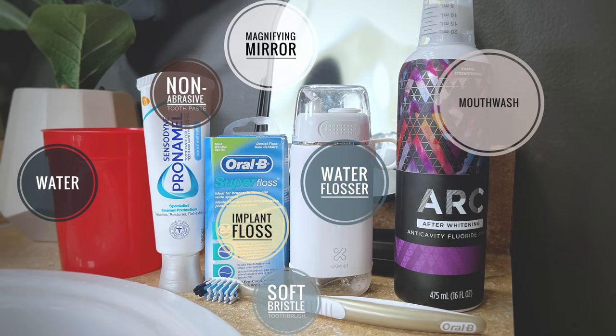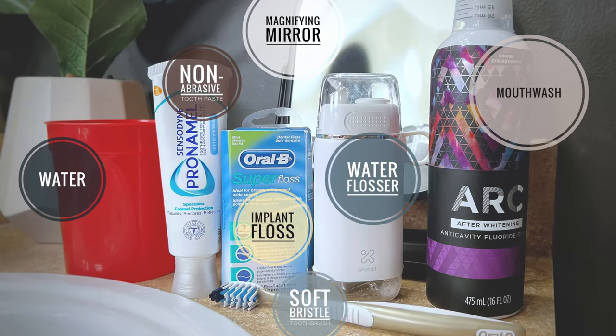Now I'm going to go over all of the products that I use every single time I clean my hybrids. The first tool is the most obvious one — a toothbrush, but it has to be a soft bristle toothbrush. You do not want to spend all this money on these hybrids and damage them with an abrasive toothbrush. Hard bristled brushes can scratch the surface and leave them susceptible to staining. Same thing with toothpaste — you don't want to use regular toothpaste. It's too abrasive. It can dull and scratch your teeth, so make sure you're getting something very gentle like Sensodyne, which is less abrasive.